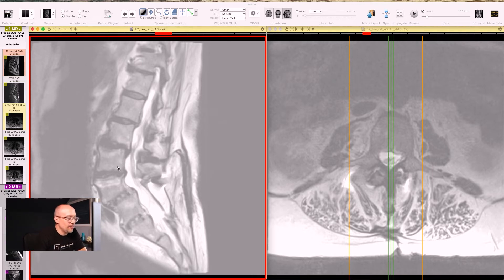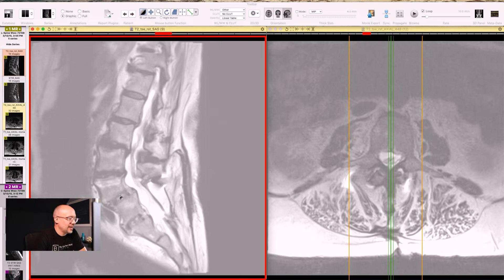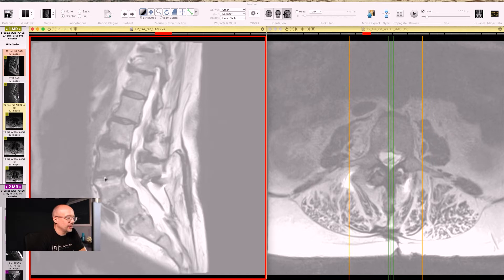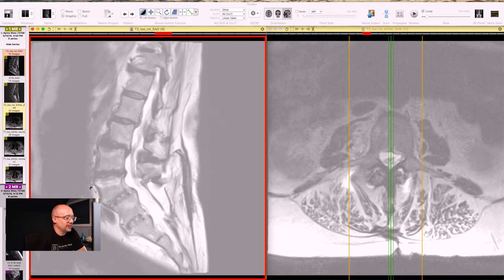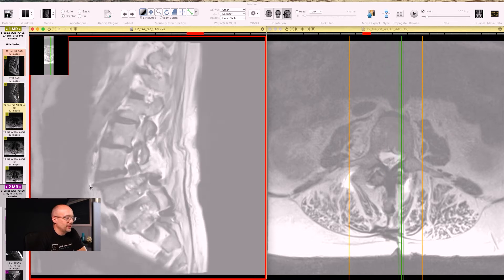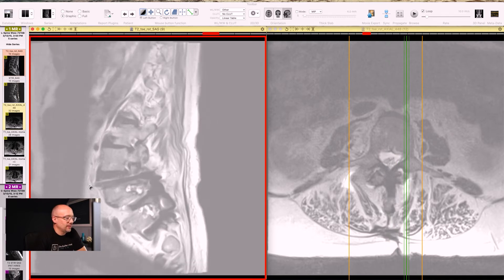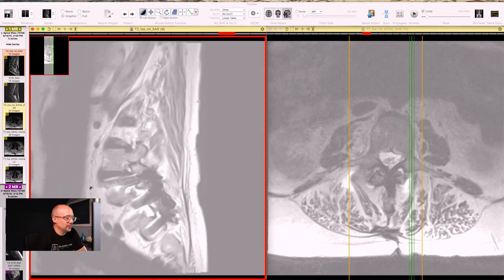The other thing that you might be taking a look at and saying, gosh, at L4, L5, on the left-hand side of the screen, that disc looks a lot different than the others. And that is because it's not, it's no longer a disc. That is where a previous fusion, watch when I scroll to the side a little bit. Bam! You can see all of those rods and screws, these big black areas going in, those are rods and screws.